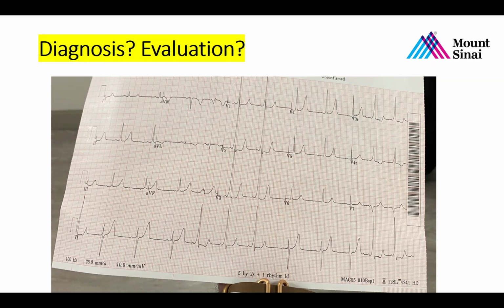Sorry, just getting my audio up. Good morning, Dr. Pass. I'm looking at the tracing at B1. A P wave is followed by a QRS and then a T wave. So I've got 2 sinus beats, and then 2 beats in a row after that where the QRS morphology has changed, as well as the PR interval. And I also see a delta wave. So I guess this is intermittent pre-excitation, because it goes back to the previous rhythm and then it happens again.